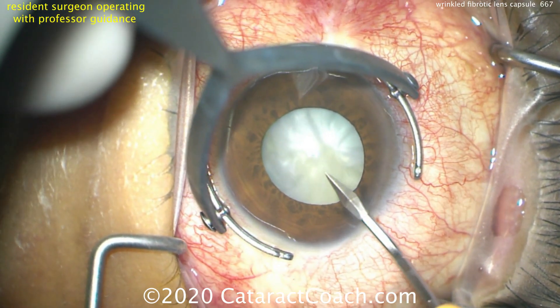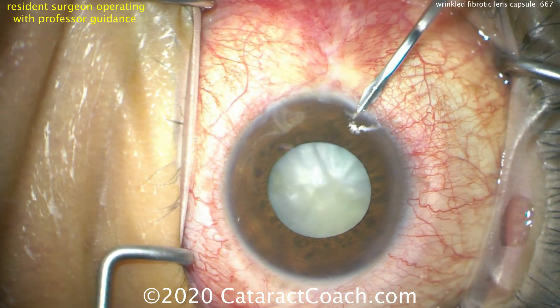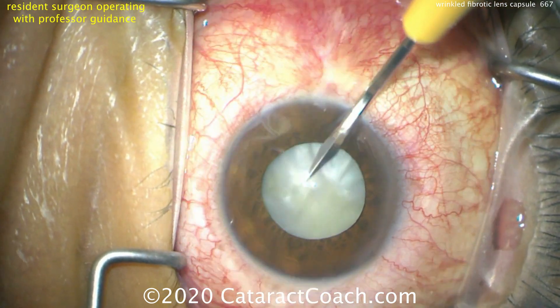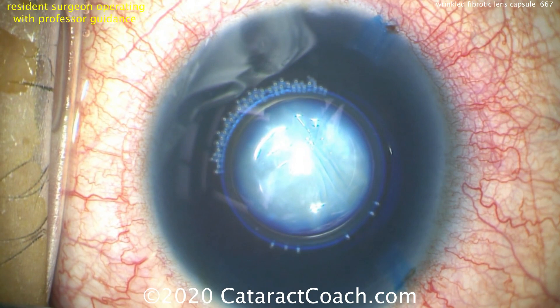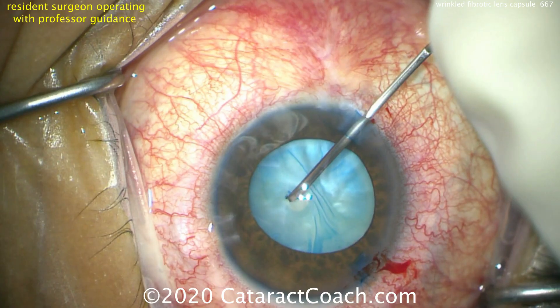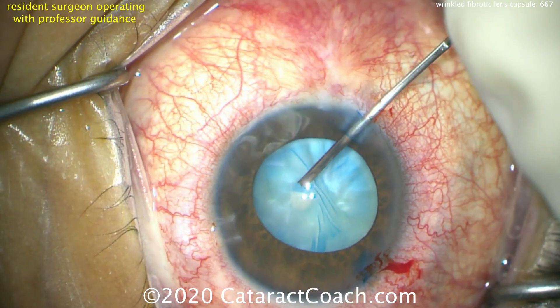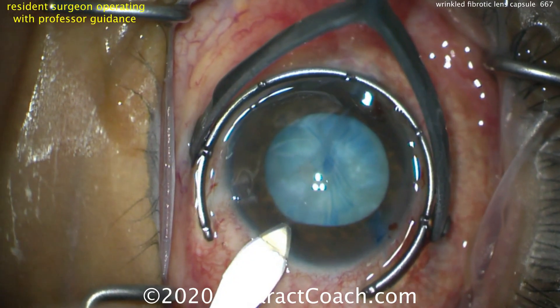We'll start off by making our paracentesis incisions, put in TriPen blue dye, and stain the capsule. If you look at that central capsule you can see there are a couple of linear lines there. So let's wash out the blue dye, fill with viscoelastic, and here we go starting the rhexis — and no milky fluid comes out, so that's a good thing.